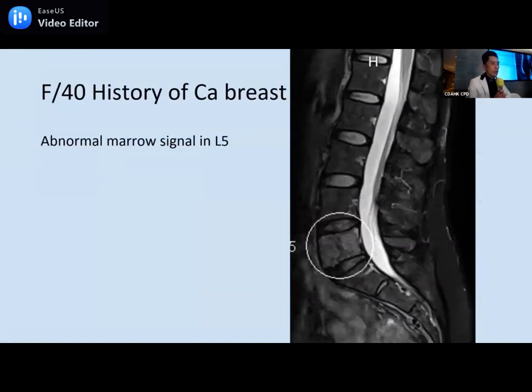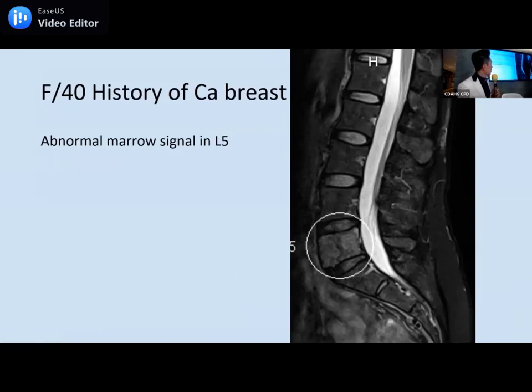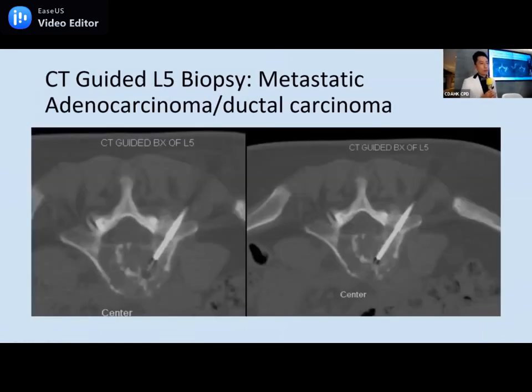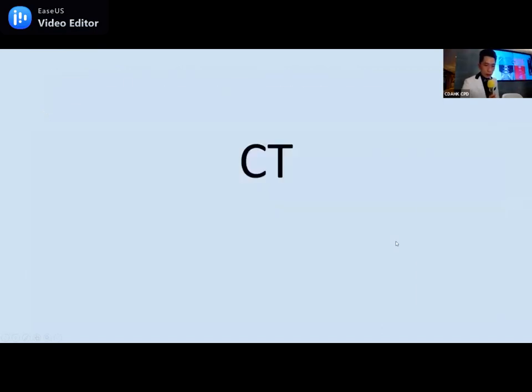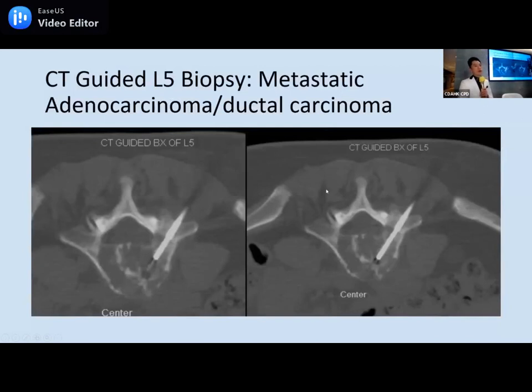One more case: a 40-year-old female with a history of breast cancer and abnormality at L5 vertebral body. Naturally, we suspected metastasis as the cause of back pain. CT-guided biopsy was performed — a needle was inserted into the lytic lesion at L5, taking multiple core passes. This confirmed a metastatic lesion from ductal primary, consistent with breast cancer.